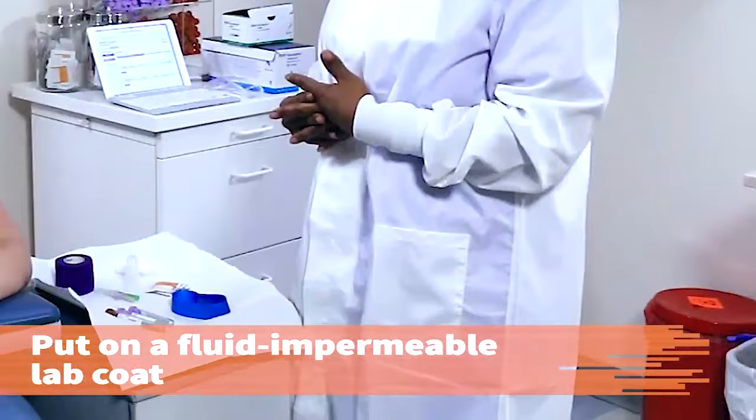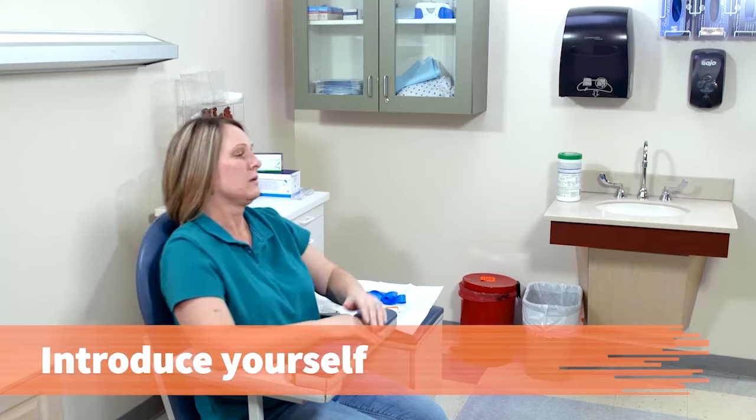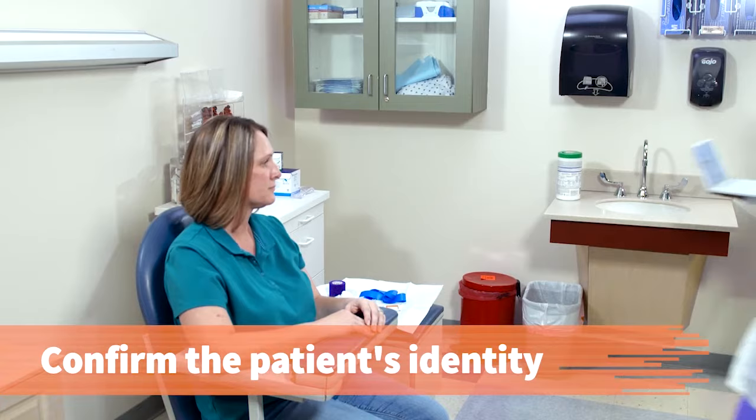Put on a fluid impermeable lab coat. Verify the patient's identity using three identifiers, such as her full name, date of birth, and the spelling of her last name, or ask to see a photo ID.